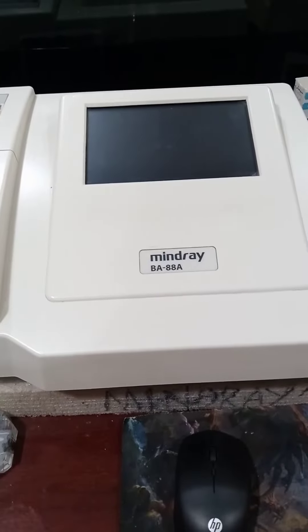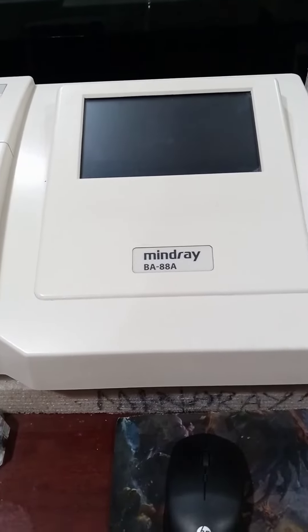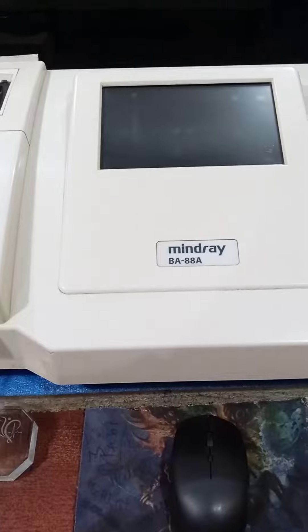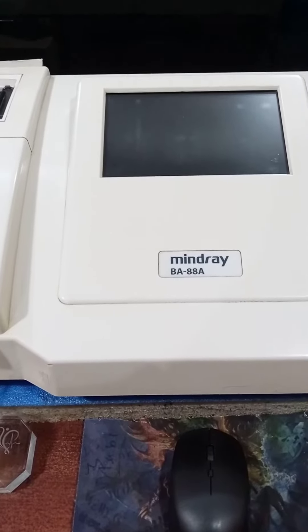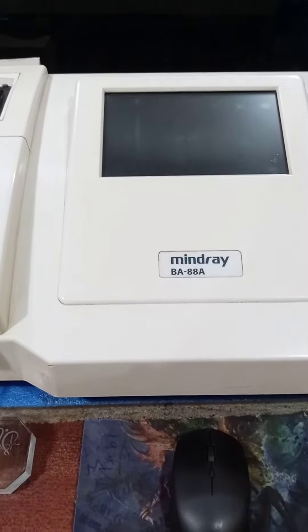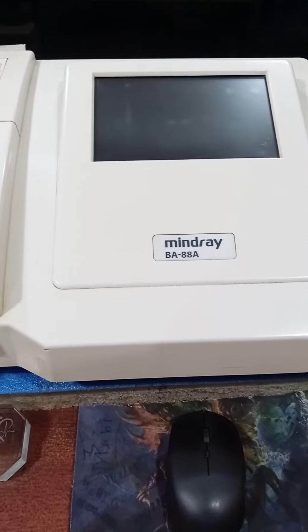This is the Mindray BA88A chemistry analyzer. Both machines here are similar chemistry analyzers. Biochemistry tests like lipid profile, LFTs, RFTs, sugar, glucose, and electrolytes — all these tests are performed through this machine.